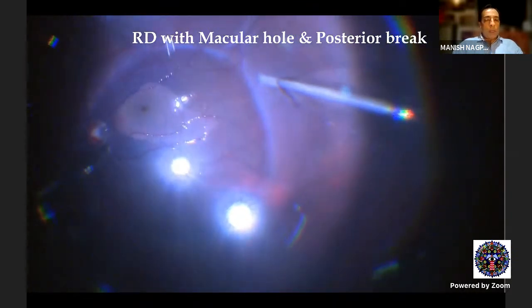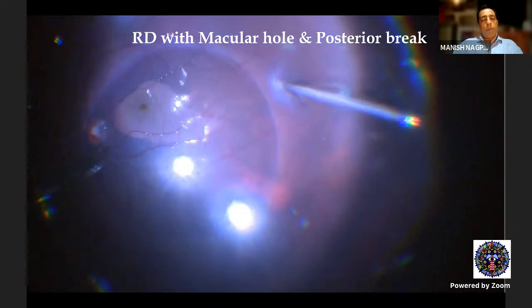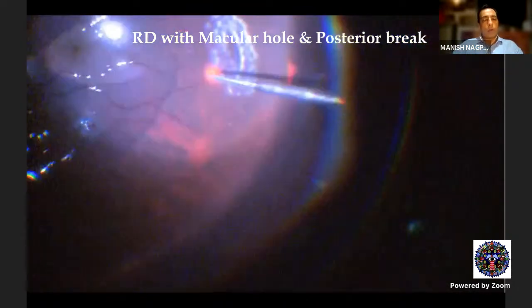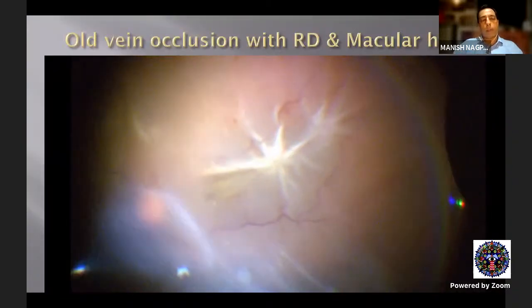But at times in a detached retina with the macular hole, we put PFCL to stabilize before peeling also. So I would always start without PFCL. If it allows me to peel well, I would go ahead. If not, I would put perfluorocarbon in that case.